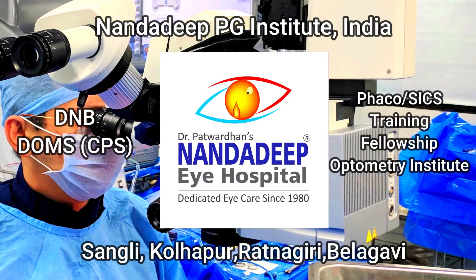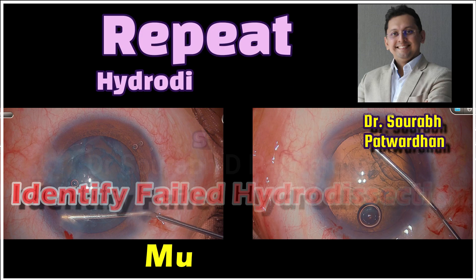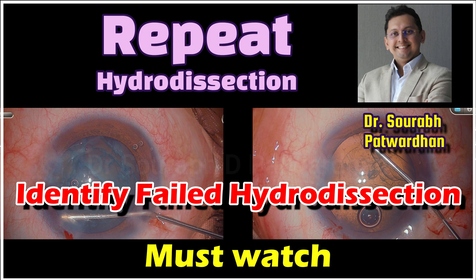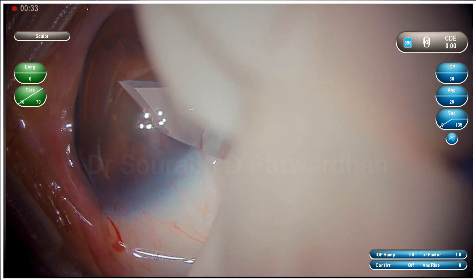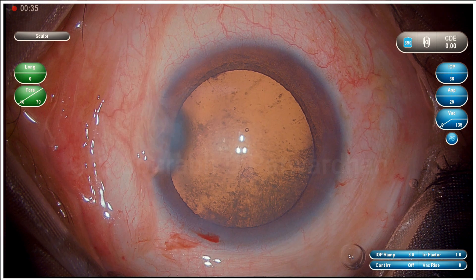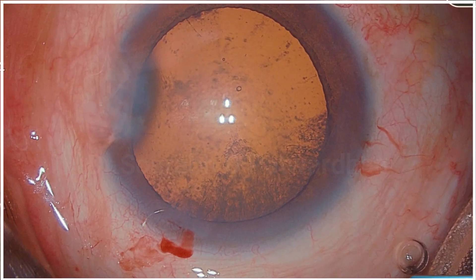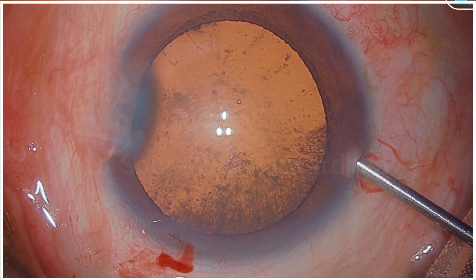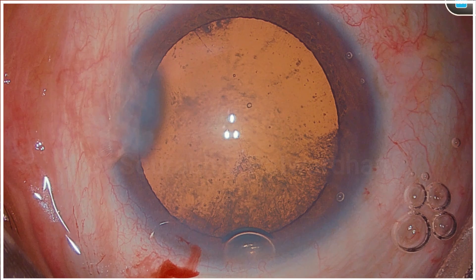Hello friends, in this video I am going to show you how to identify failure of dissection and what is the right time for repeating the hydrodissection. On my YouTube channel you will find many videos where I share many small tips which will help you in improving your surgical skills. This is a soft cortical cataract, and doing hydrodissection is even more essential when you are dealing with a soft grade of cataract.